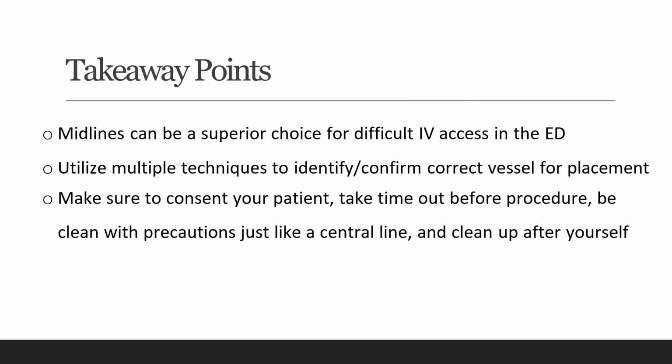All right, so let's wrap everything up. With the first point, midlines can be a superior choice for difficult IV access in the ED. We have those traditional peripheral IVs that really aren't long enough to give us those key parts of length of catheter in the vessel to keep it from coming out. And compared to central lines, these may be more cost effective, and they can almost have just about all the same things placed through them. In the ED setting, we're probably mostly using vasopressor therapy. I don't think many people are placing TPN or putting chemo in the ED, so we don't have to worry about those too much.